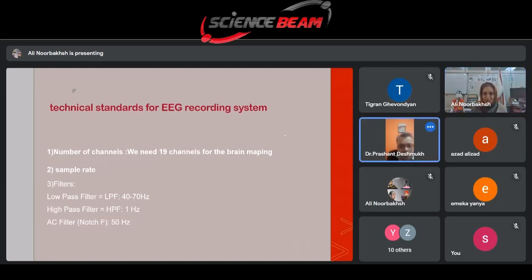Is it okay? Can I ask? Can you compare the filter frequency or artifact frequency? What is the difference between those things? Yes, we can filter, because for EEG we can set between 1 Hz to 40 Hz. You can set the high pass and low pass.